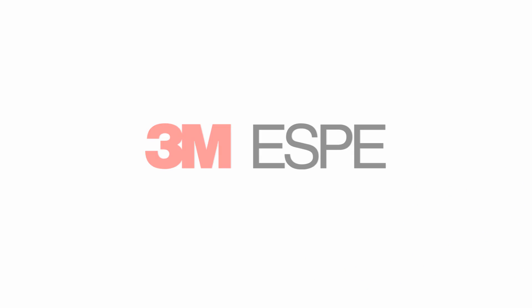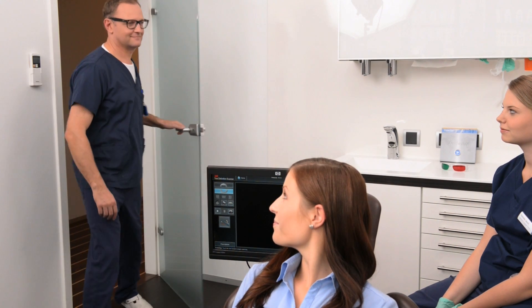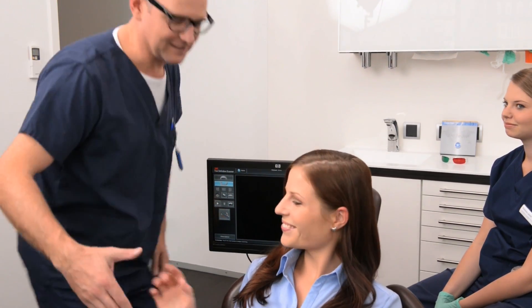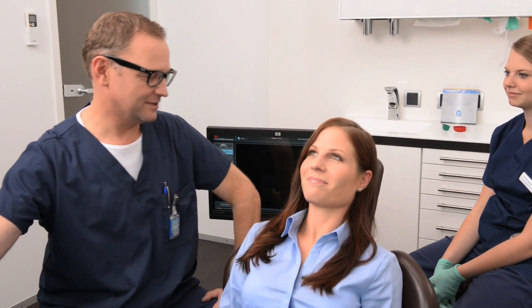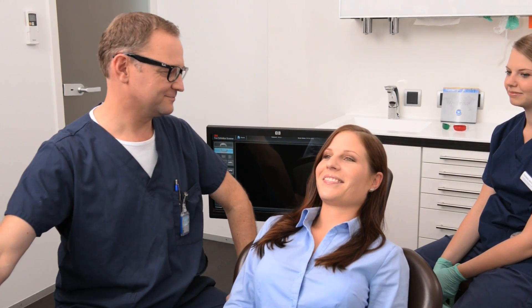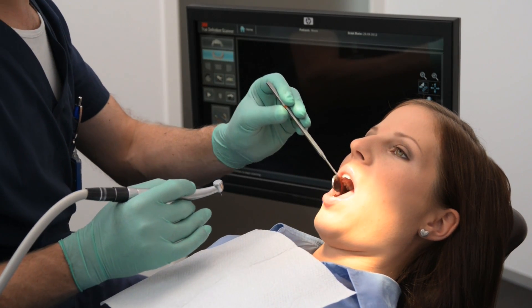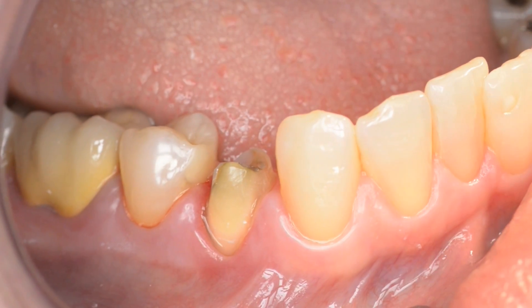3M ESPE — 3M True Definition Scanner Step-by-Step Case Procedure. This comprehensive tutorial will walk you through each step of creating a digital restorative case with the 3M True Definition Scanner. Some chapters are also available as stand-alone tutorials from the main menu if you wish to revisit a specific topic. We wish you fun and success in becoming a true digital office.